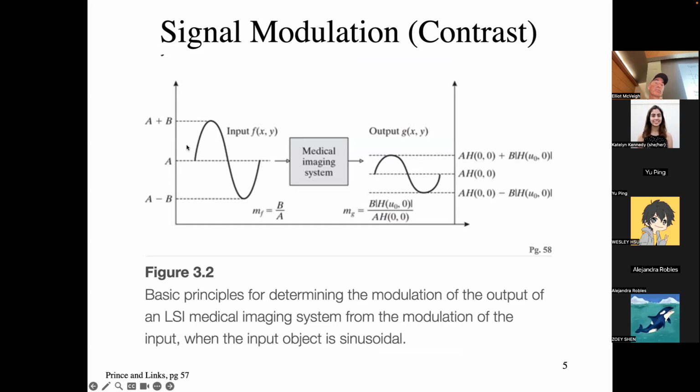And that is, if I put a sine wave signal into my imaging system, so now I have something I've painted on the wall. It could be this modulating sine wave on the wall. I put up my camera or my imaging system, and I take a picture. And then I ask, what is the amplitude that gets transmitted to my final picture through the system that made that picture? And I do this for different sine waves and figure out the relative amplitudes.